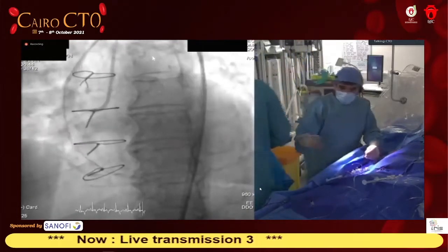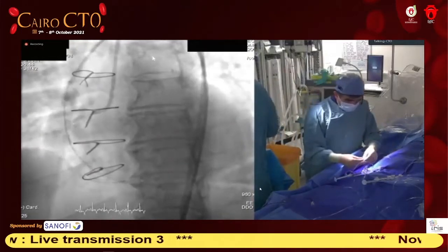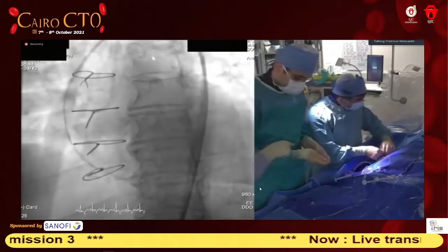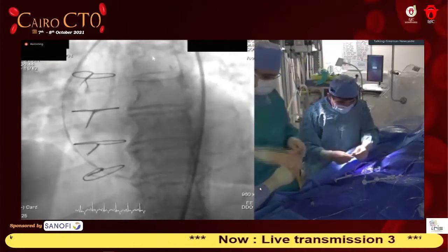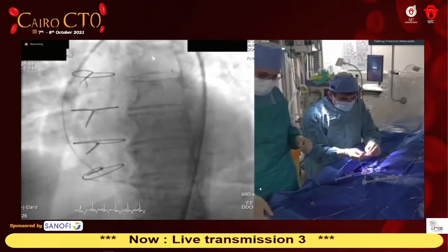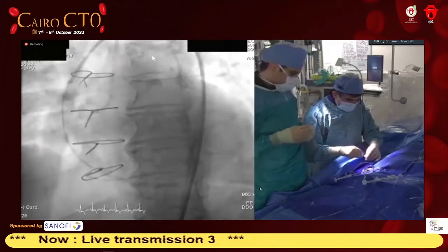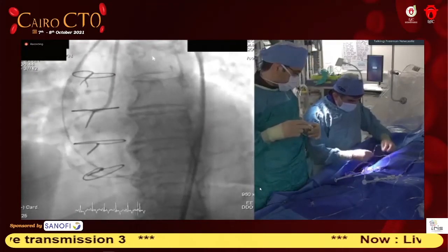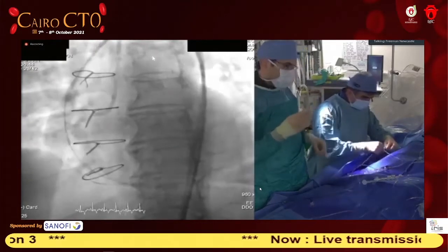It's very good to see that you cut the tip of the RG3 because it is bent. Yeah, it's easy, usually it doesn't happen, but for some reason here we had a lot of resistance and the wire got bent. But if it is bent in here, it's much easier to cut it, and you need surgical scissors, so it's very soft to go in. Yeah, so it's a sharp cut rather than having any little bends on the wire that will compromise your delivery of the microcatheter. So now all I'm going to do is deliver this microcatheter.